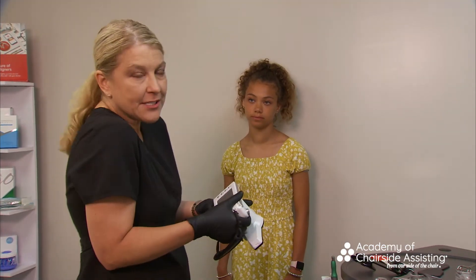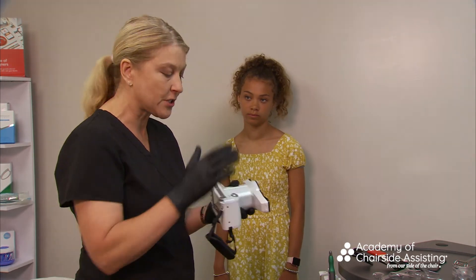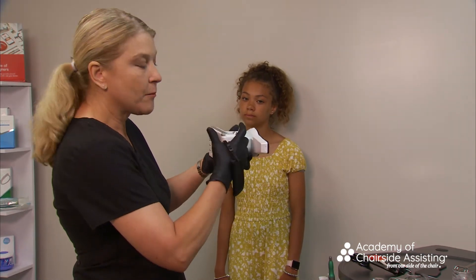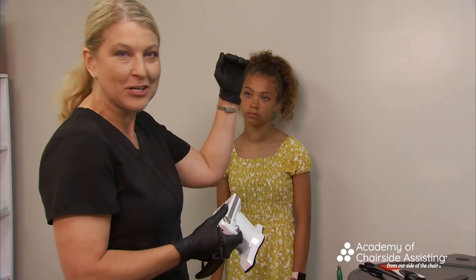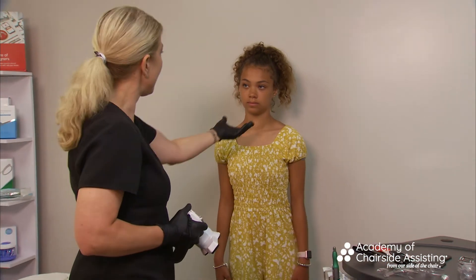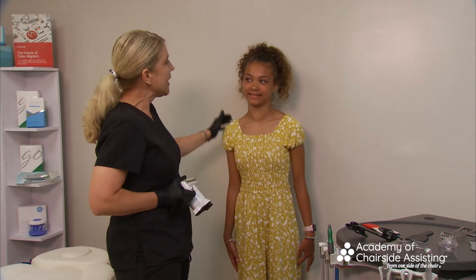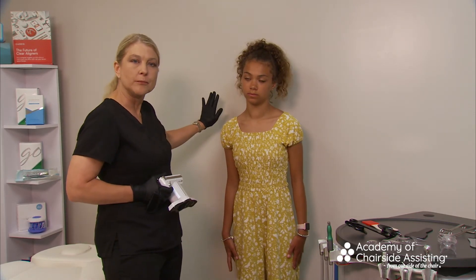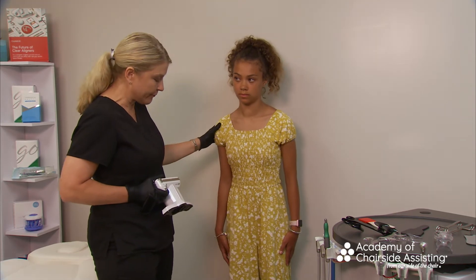Notice how light this camera is — it weighs two pounds. When holding it, you always want support. Take your hand as if you're shaking someone's hand and just slide the camera in. The lightweight design is why a lot of team members love this camera — it doesn't raise anxiety. Notice Kylie's height; she's young and getting ready for ortho, which is why we're taking these photos.